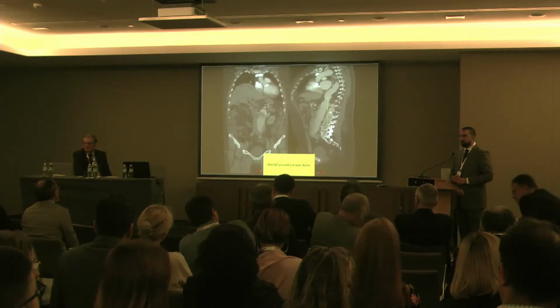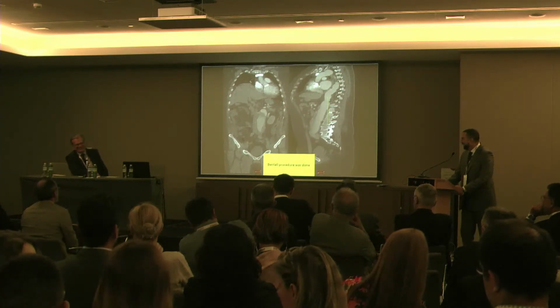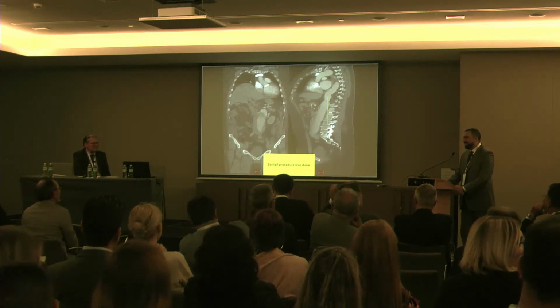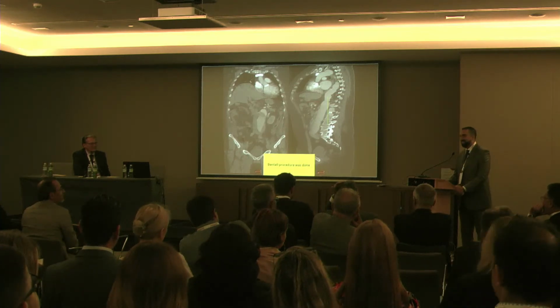Any comment? What did you do there? We performed the TEVAR with the proximal debranching in zone 1. Zone 1. Yes.